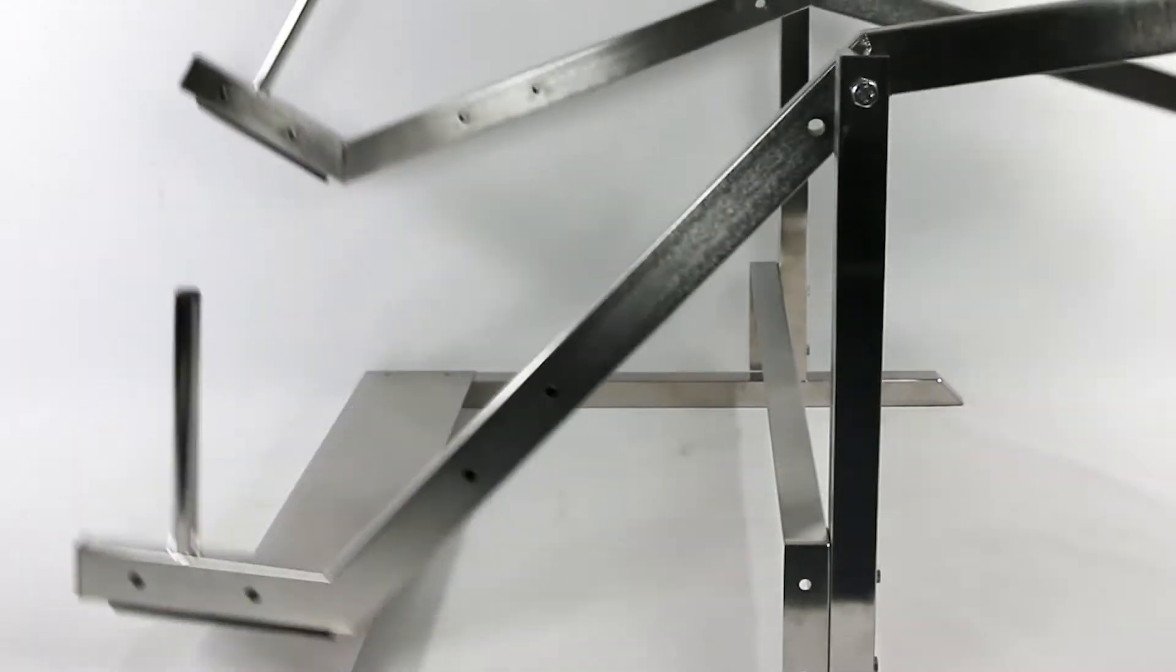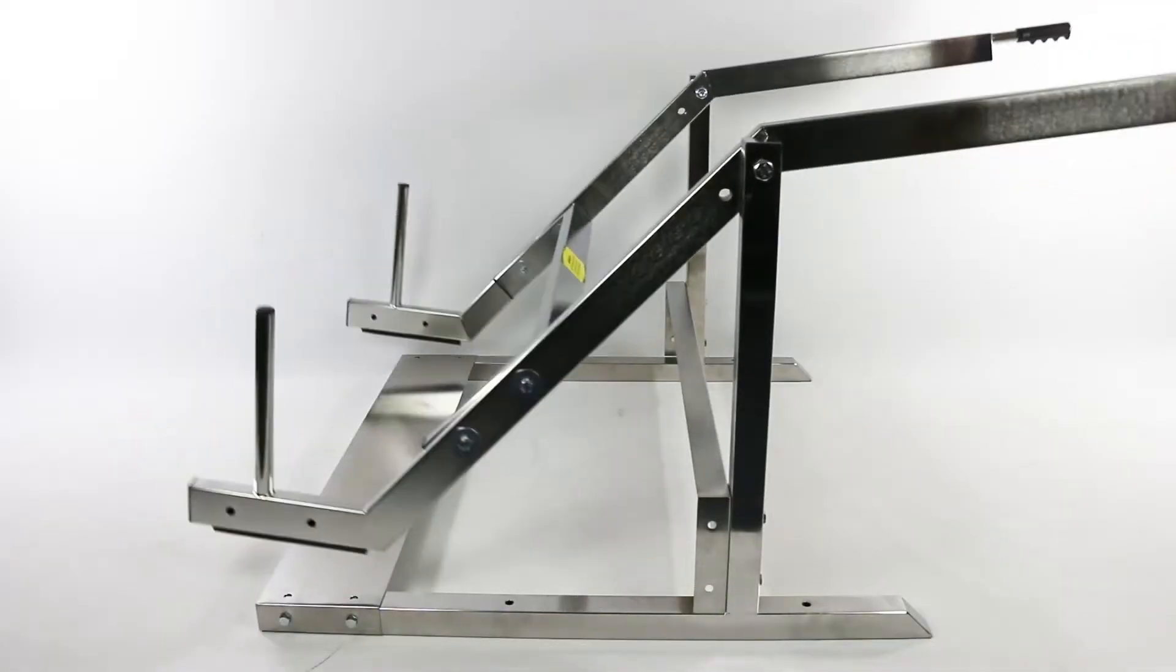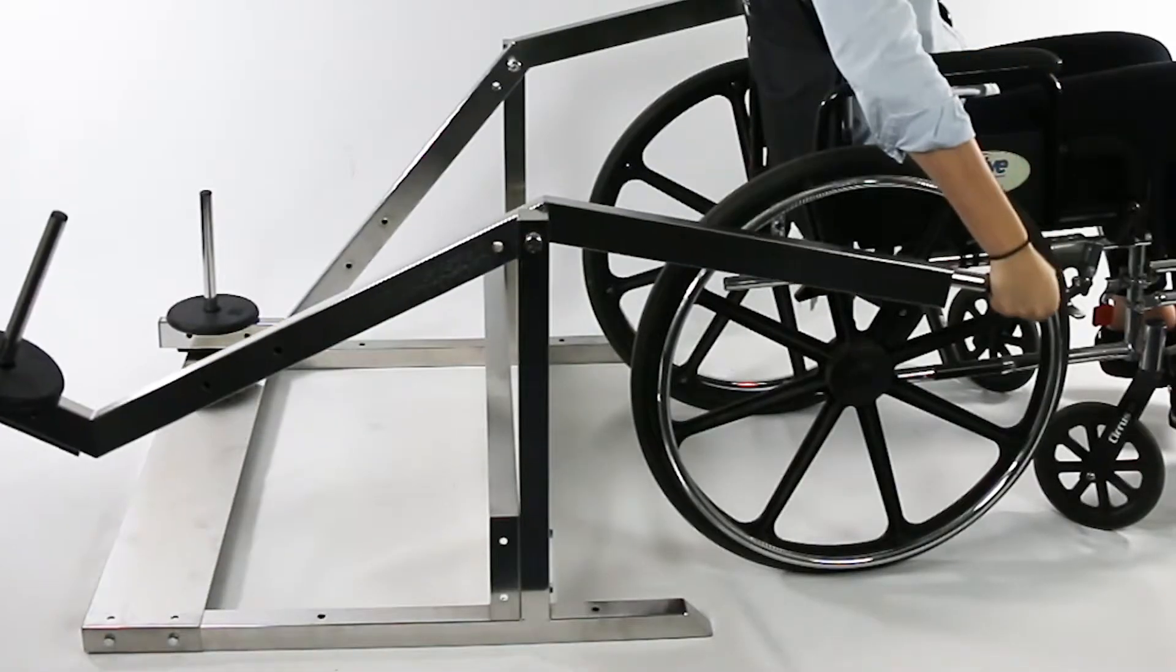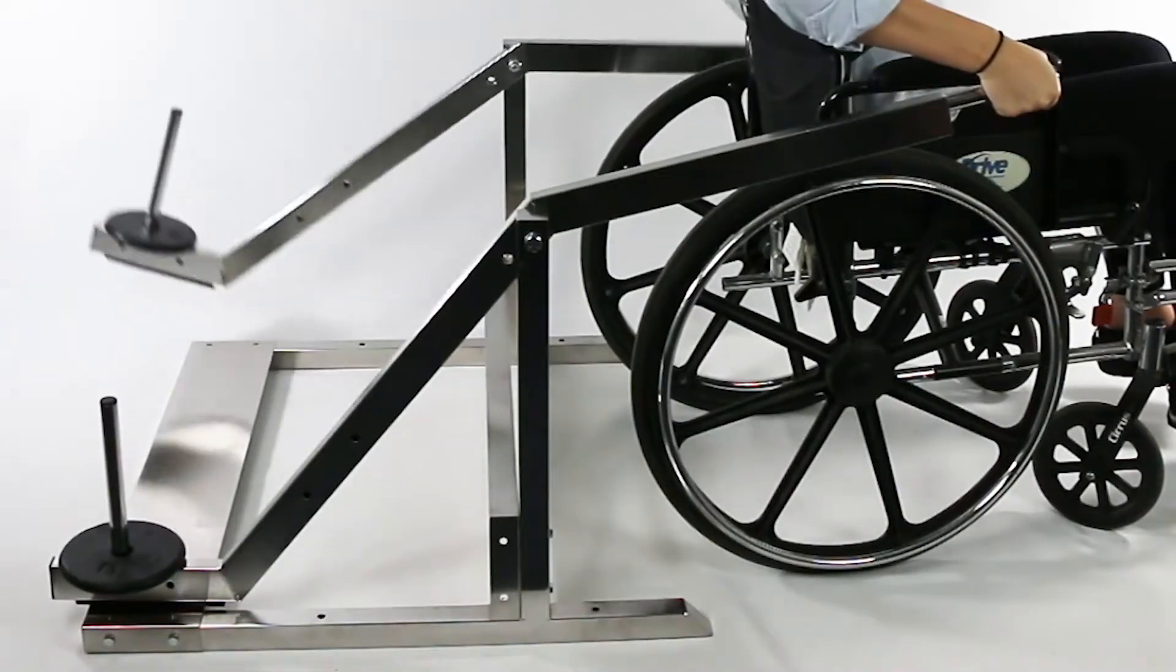The arms of the rickshaw exerciser can move independently or in tandem. The cross piece locks the two arms together so that they work in tandem. Consult with a therapist to find out if tandem or independent movements are best for you.